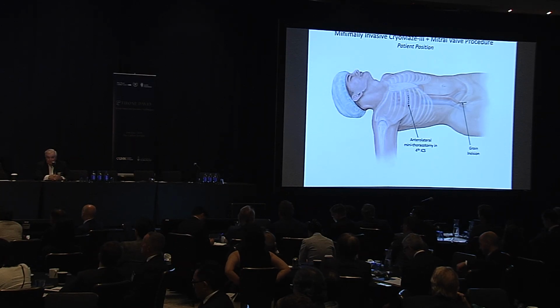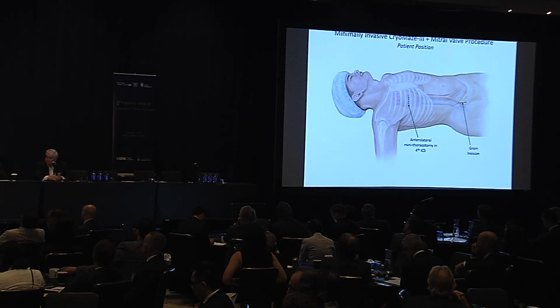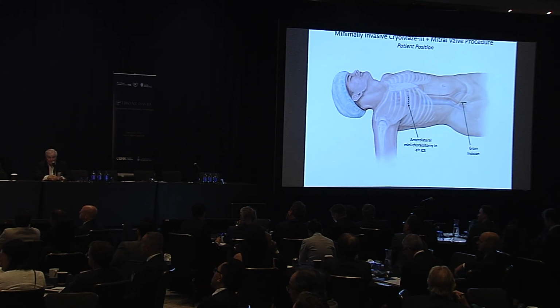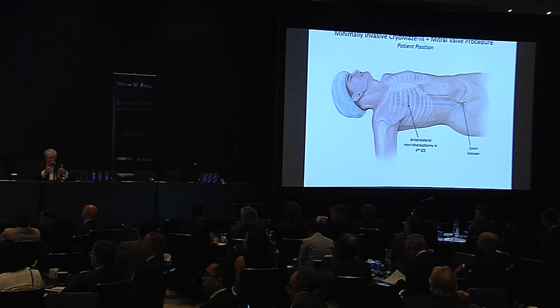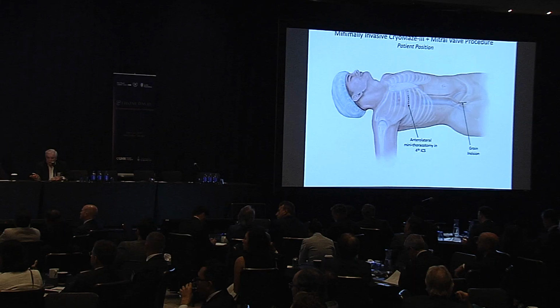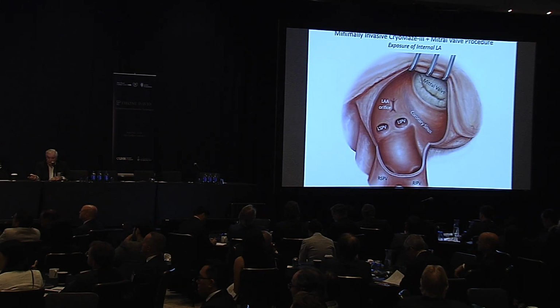As you know, Ralph, once the radio frequency came out in around 2000 with the devices and so on, Ralph added RF to cryo and made the procedure a lot quicker. And so it's the one that we sort of teach now, but you make the lesions differently, but they're the same electrophysiologic lesions, and that's called the maze 4. But the advantage of it is it's quicker.